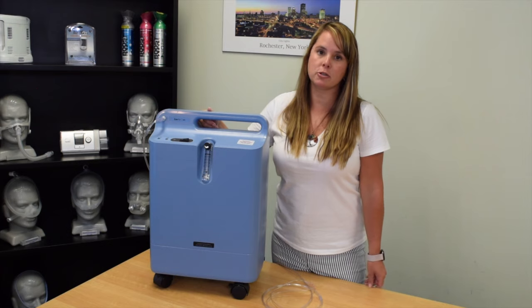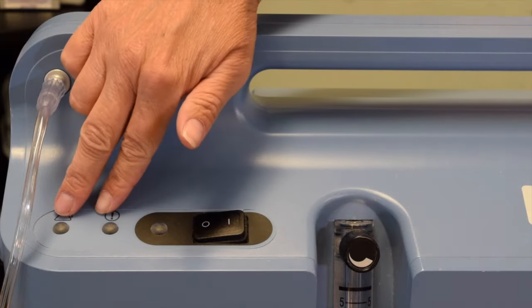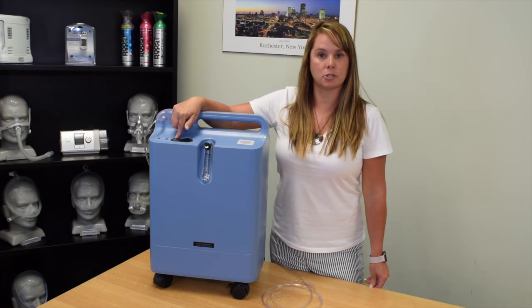I'm going to go ahead and turn our concentrator on. You'll see that these three lights are going to illuminate. These two indicate our alarm, and then this indicates that our concentrator is working correctly.